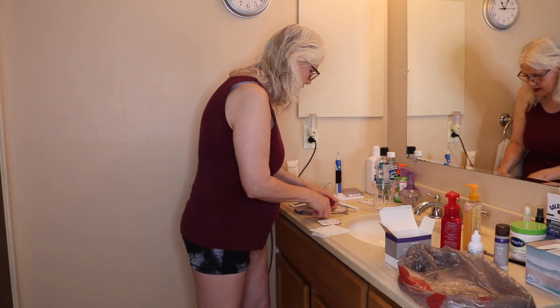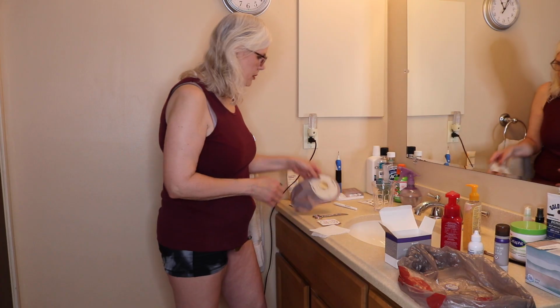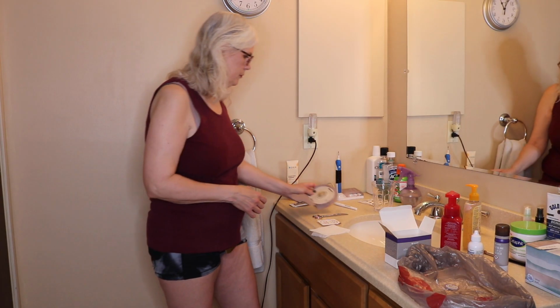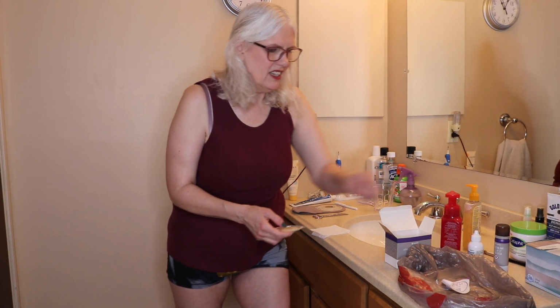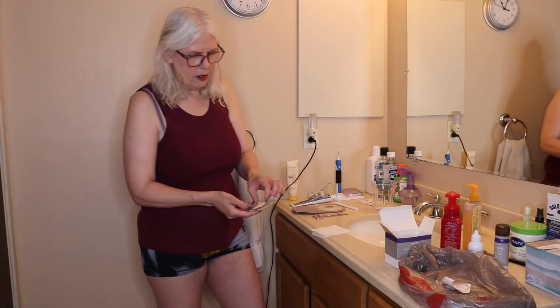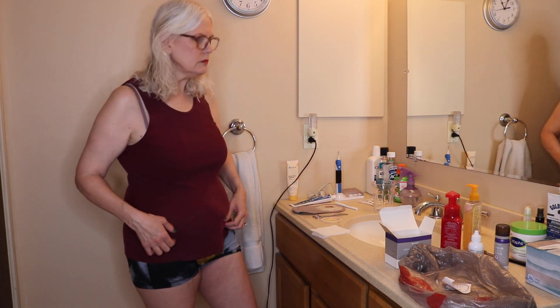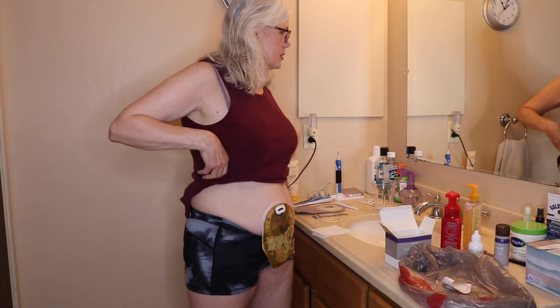So the other nice thing about having it see-through is that when you hold it up to measure it, you can make sure you can see through there and you can see that it's going to go around your stoma. So I'm going to leave the adhesive on here for right now, just to make sure when I'm ready, I'm going to make sure that it is big enough. But if I had my other type of bag, it would have a clear covering on there that I would get ready to go. I take that off. This has a double-sided, it has another covering on this side. I just leave that be until I'm ready for that. And here we go. So I'll fold this up so it doesn't get in the way.